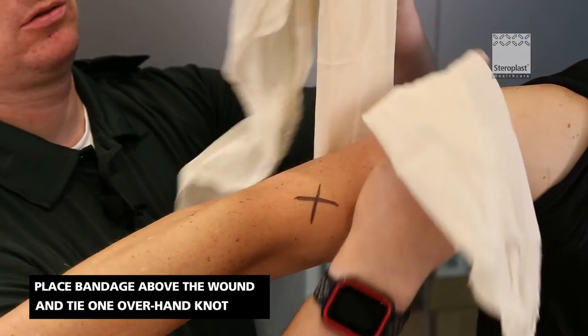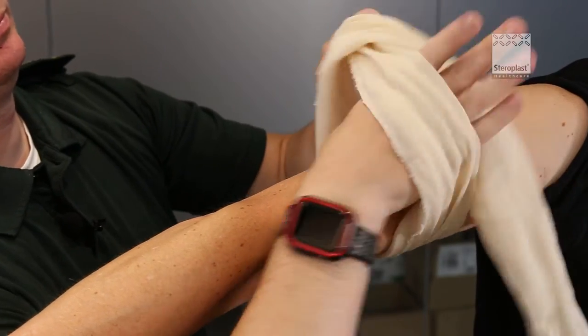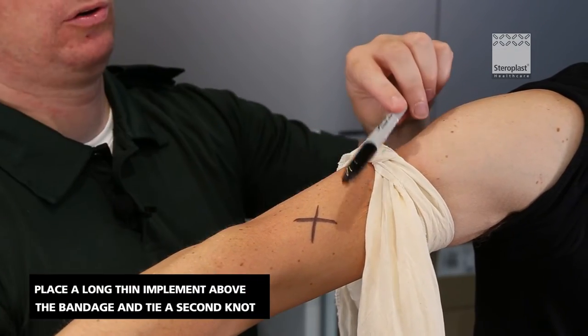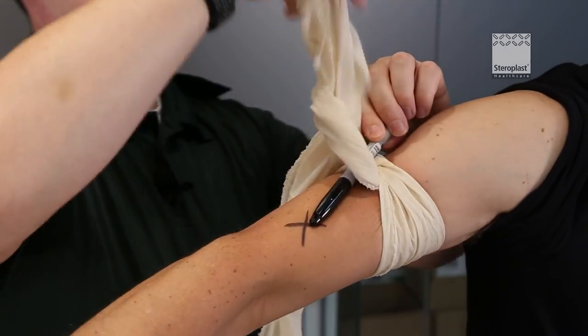Place the bandage above the wound and tie one overhand knot in the middle of the bandage. Pull it as tight as you can and then take a pen or another long thin implement and put another knot around that.